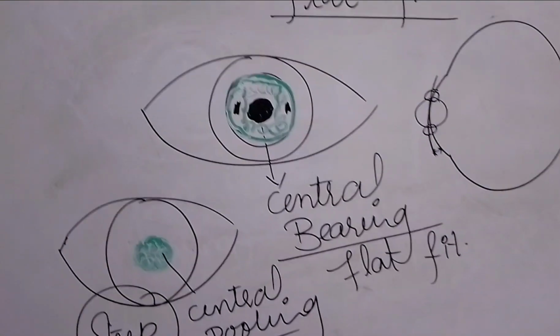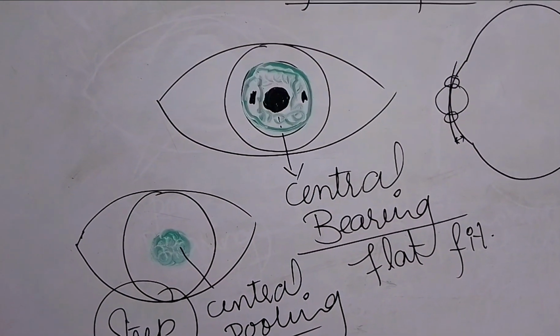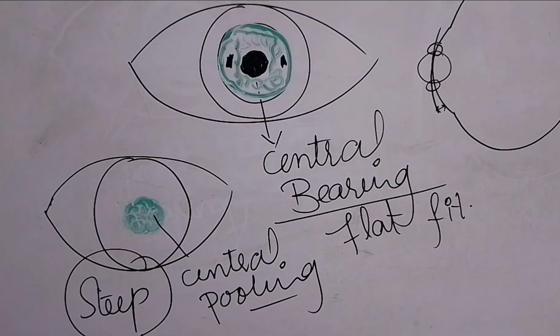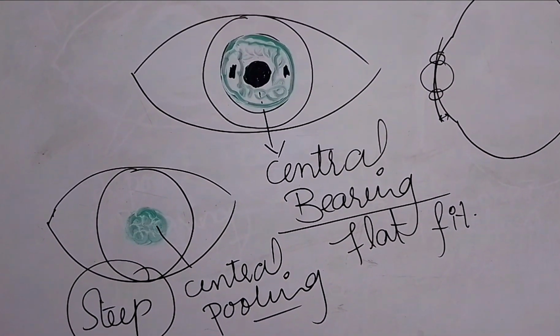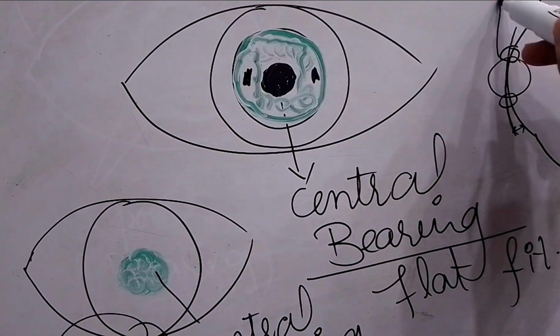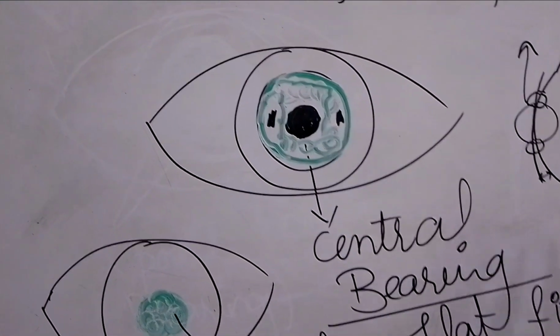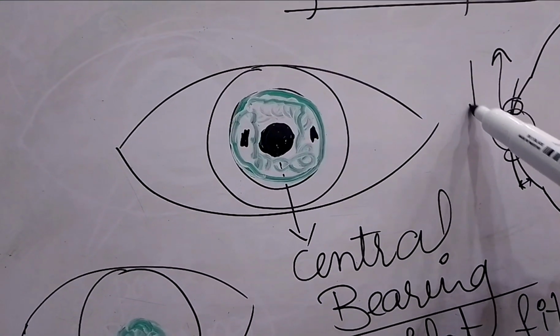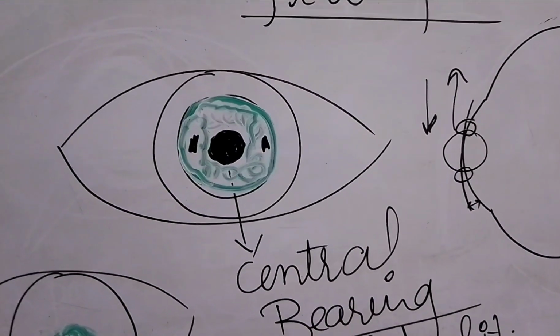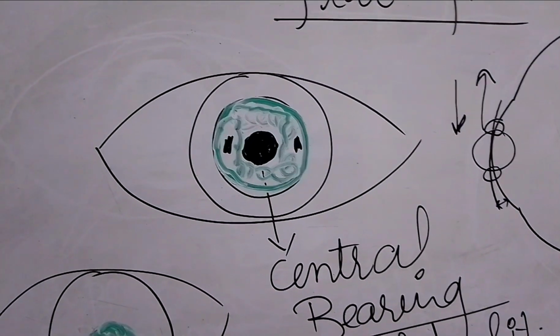And what are you going to see in the fluorescein pattern in motion, after the blink? You are going to see after the blink whether there is an unobstructed movement or not. The contact lens should move up, there should be an upward unobstructed vertical movement of about 1.5 millimeters, and it should return to its normal position after 2 to 3 seconds.